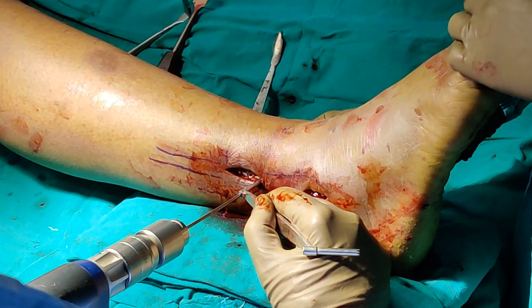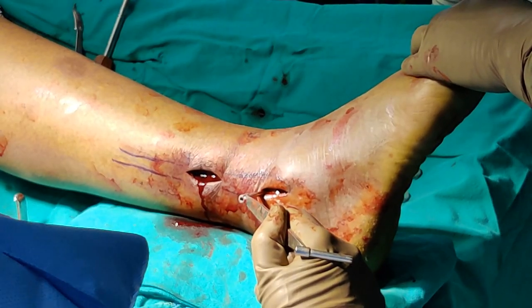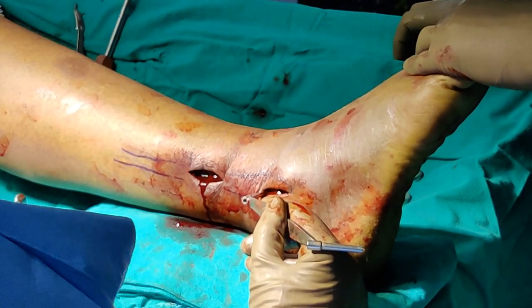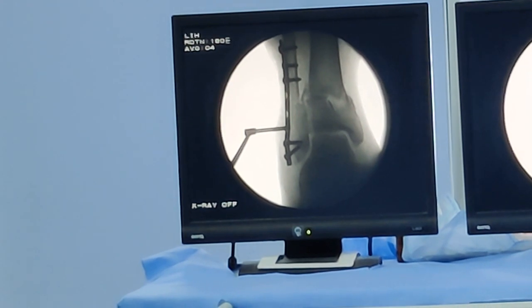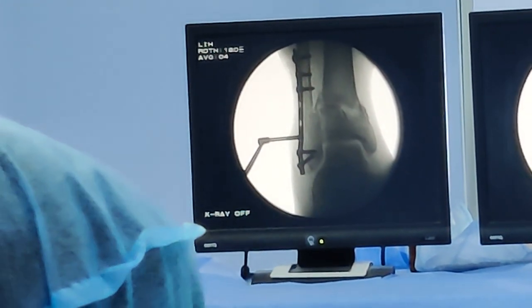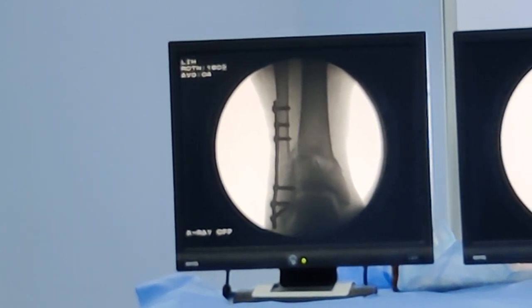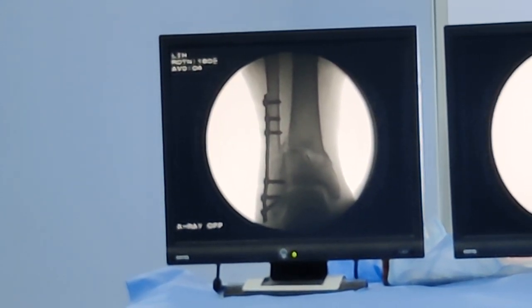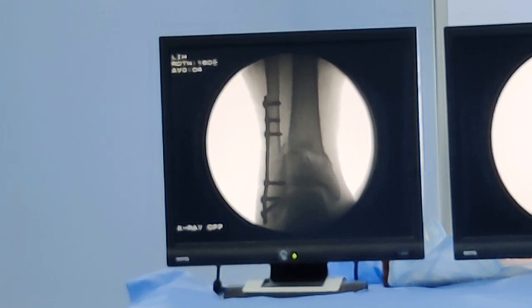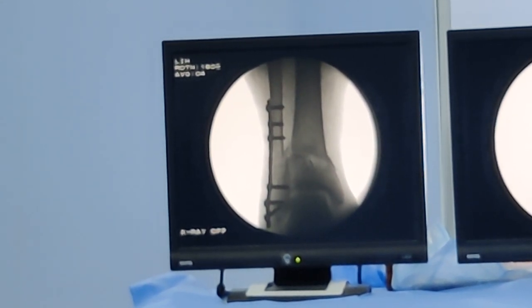I am going to use a third screw and that will be more than enough for the proximal fragment. Using the same incision with a 3.5 drill sleeve, I am checking my position on the C-arm. The drill sleeve is right in the center of the hole, meaning our position is good. We drill and replace with a suitable size screw after measuring. The distal fibula is nicely reduced — we have put 3 screws proximally and 3 screws distally, which is more than enough. I will see if I can put one more screw to pull the distal fragment even closer to the plate and reduce a 1-2mm gap still seen at the fracture site, but overall I would accept it.